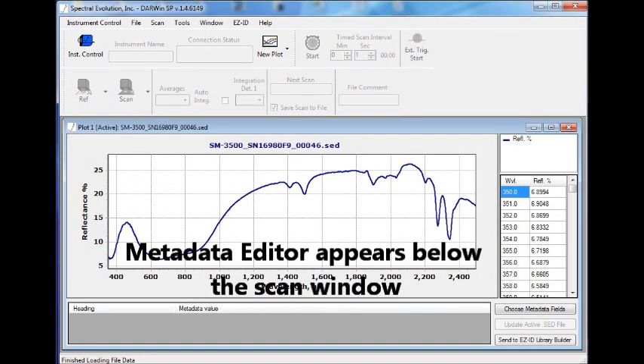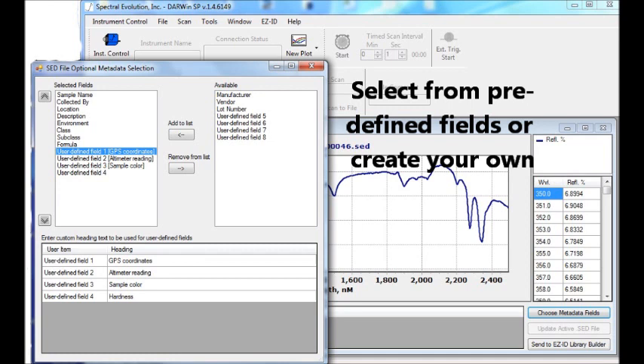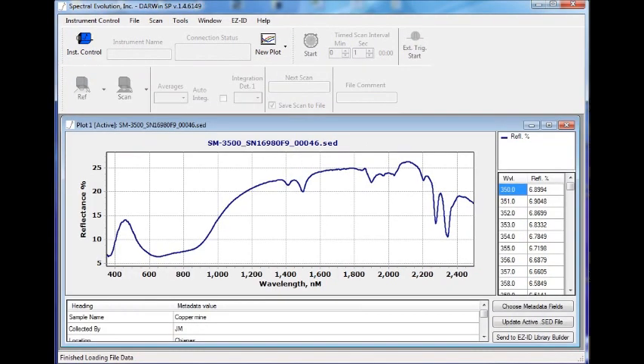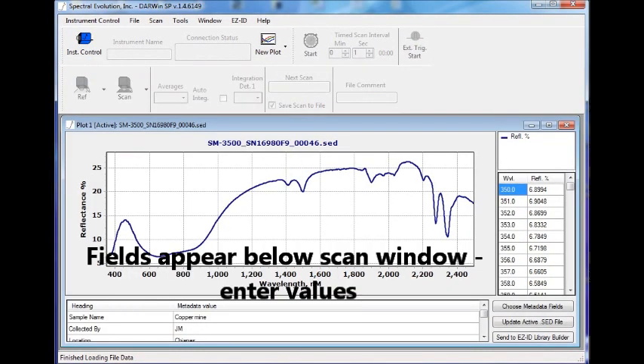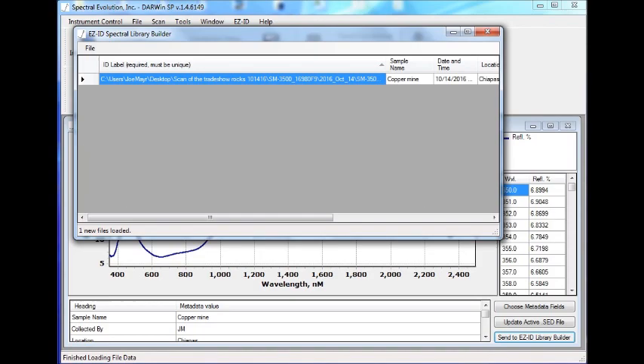Select Choose Metadata Fields from the right-side window. Select from predefined fields and define your own custom fields. Enter values in these fields — they appear below the Scan window. Name and save the library as you scan, or do that later. Select Send to EasyID Library from the right-hand column.